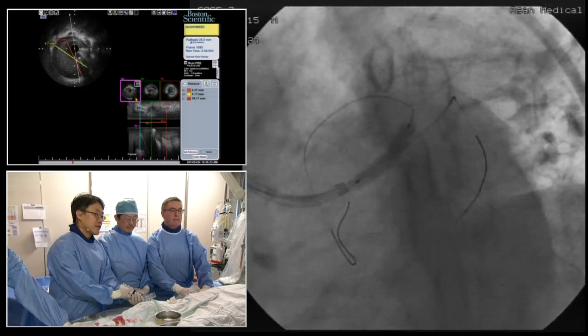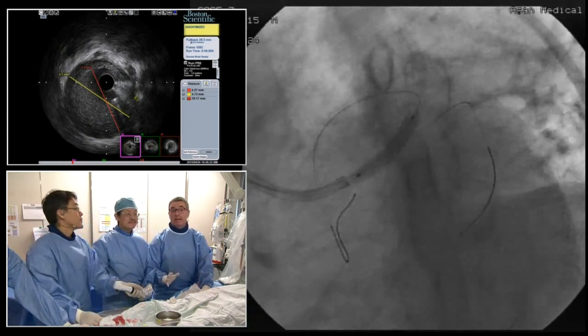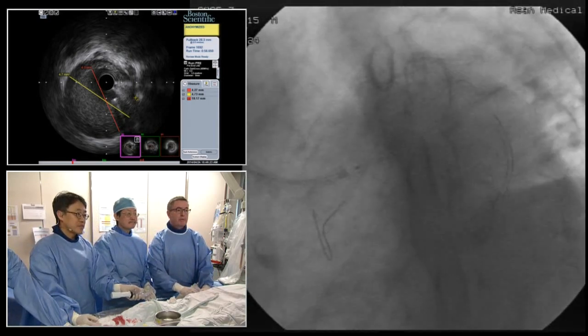That's 12? 12. Come down. Okay, that's great. Now I'll just have a look with that. So the patient's perfectly hemodynamically stable, blood pressure and ECG look pretty good, so no problems there.